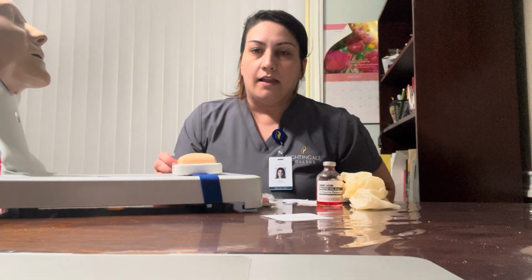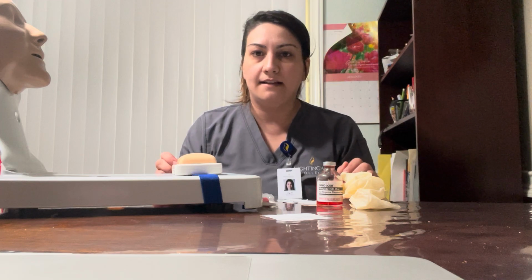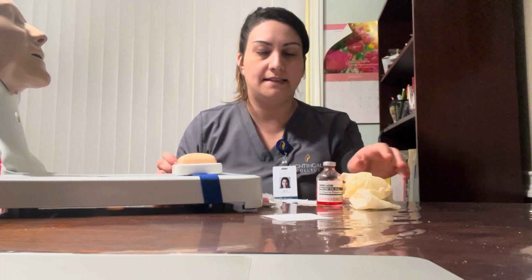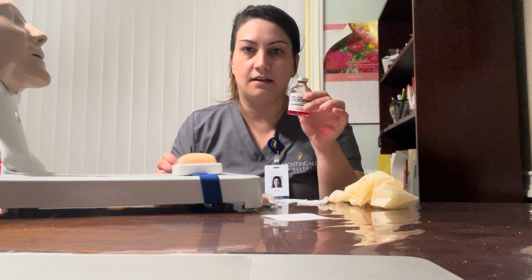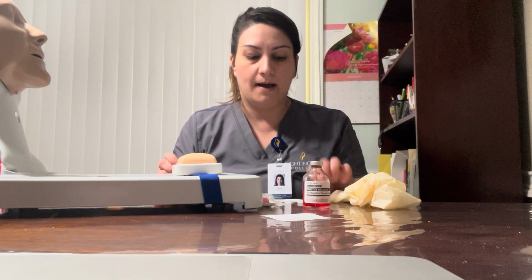I'm from Nightingale College. I'm going to be presenting the intradermal injection video. I have my appropriate supplies here. I have my clean gloves. I have my medication. I have my cotton swabs and my alcohol wipes.